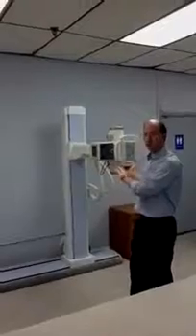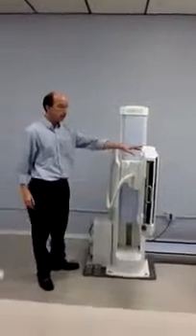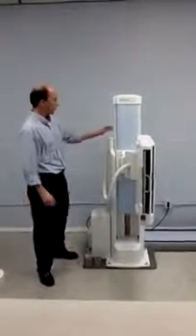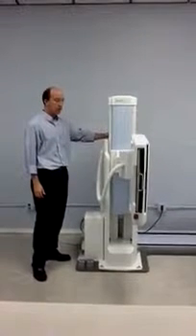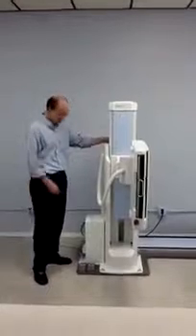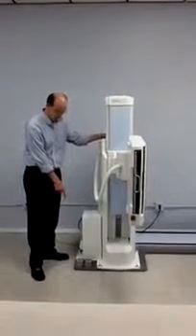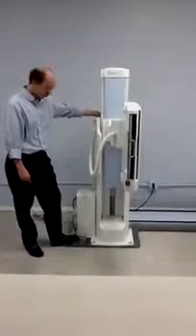This position is set up for chest imaging. The image receptor operates motorized by two means: two buttons located in the back of the tube stand, one for vertical up and one for vertical down. You can also control the movement by means of a supplied foot pedal for both up and down movement.